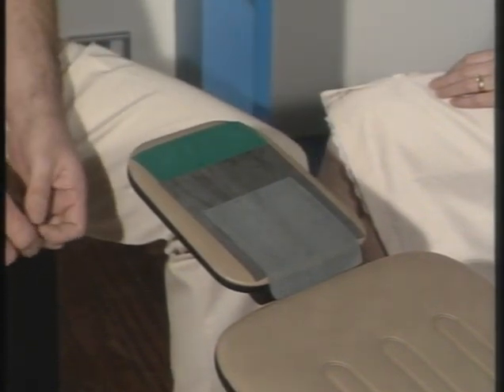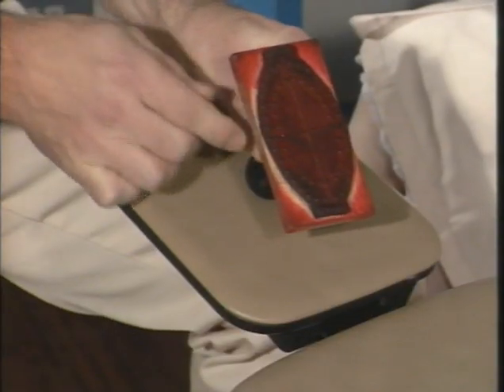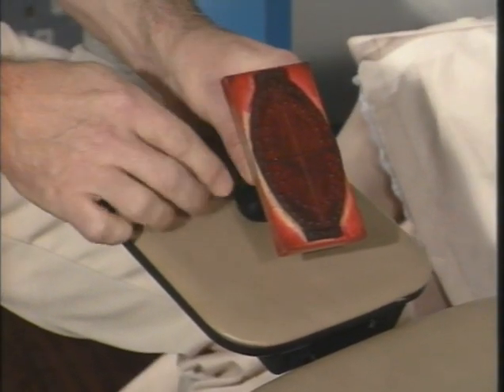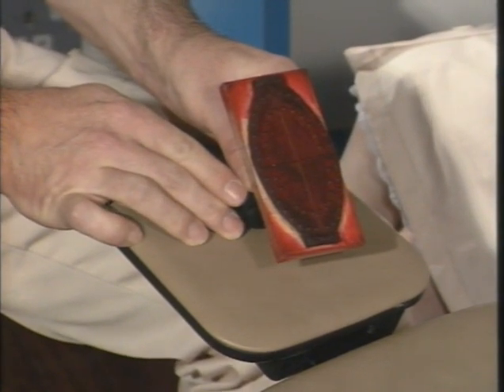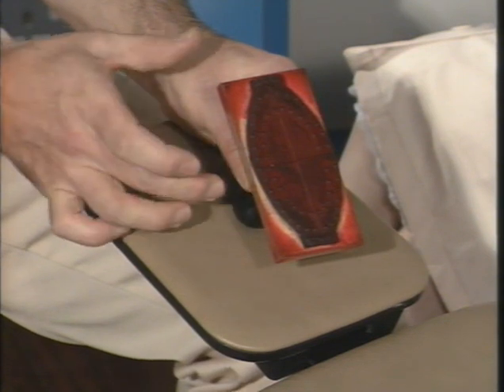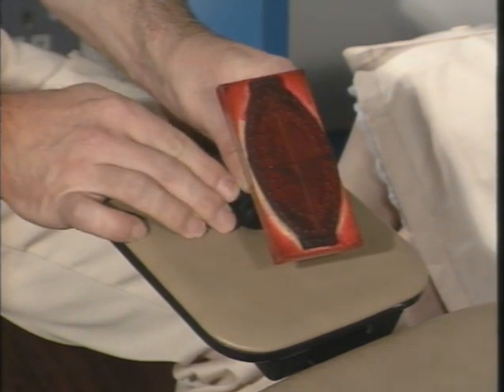The sheets themselves are normally cut into 6-inch squares, which are a convenient size for use in the mouth, but obviously if you're dealing with children, then there's a 5-inch square, which is specifically made for that purpose. A stamp of average tooth positions is very useful for locating the tooth centres on the dam. You can see on this stamp that we have got the arches outlined, both the permanent teeth and the deciduous ones. This helps to ensure that you can get the teeth adequately spaced, and therefore you have the correct amount of dam in between the teeth.